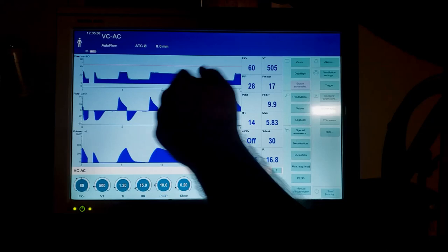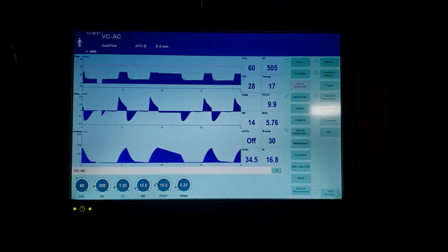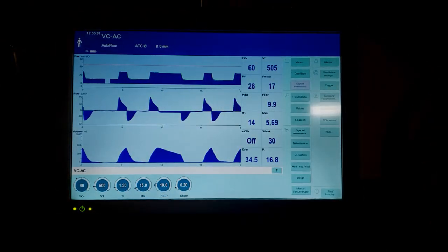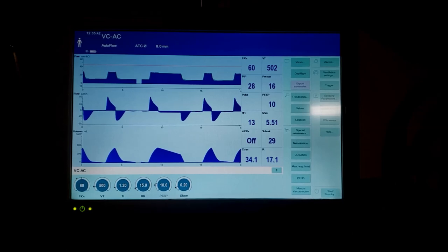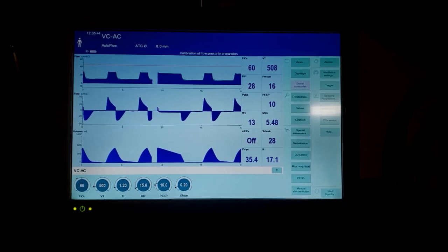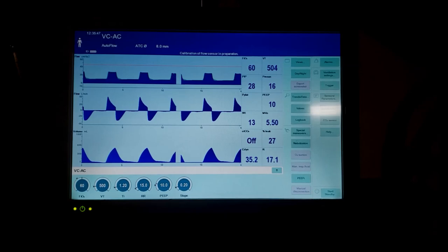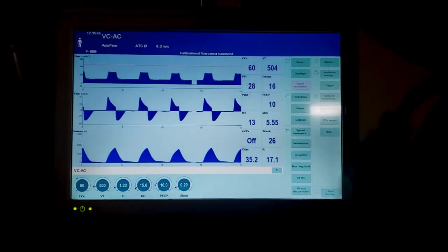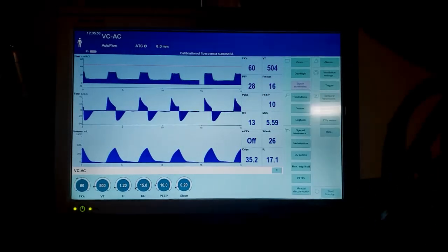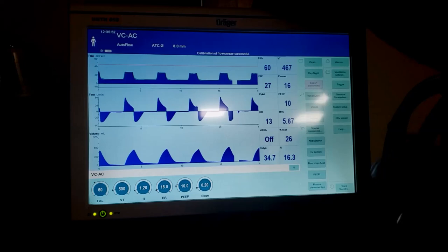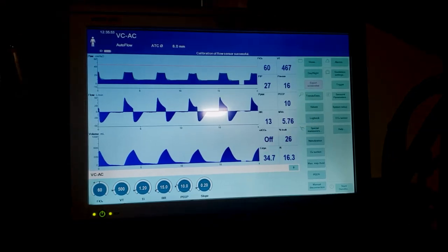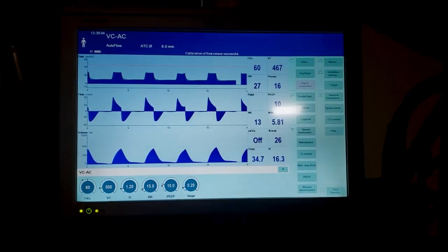The plateau pressure tells you about their static compliance. It didn't read in that case, but you can see it's really close to that 28. We're probably about 27 or so. Plateau pressure greater than 30 to 35 is indicative of ARDS and inflammatory lung disease. We watch the plateau pressure to tell us about that static compliance. That might be a little bit too much information, but that one's for free.